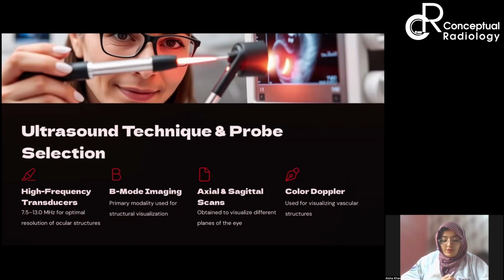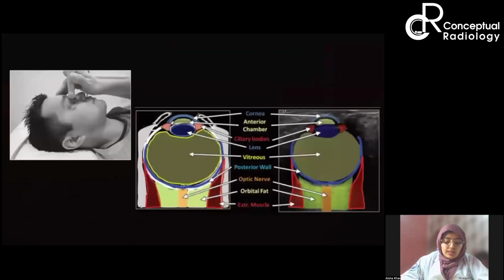चलो, now we are going to show you a visual illustration. तो इसमें we can see कि eyes closed हैं, patient is lying supine, the neck and the face should not be moving, only अंदर ही अंदर eyes have to move, and a lot of generous amount of jelly has been applied. So this, you are holding it in the short axis, and then you can rotate it 90 degree also.